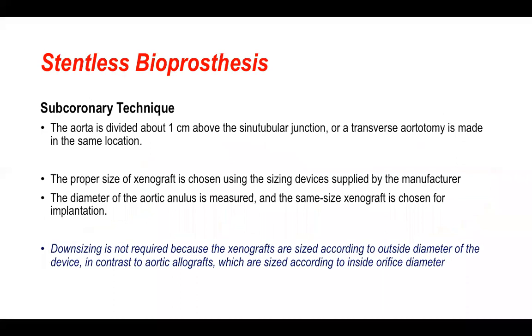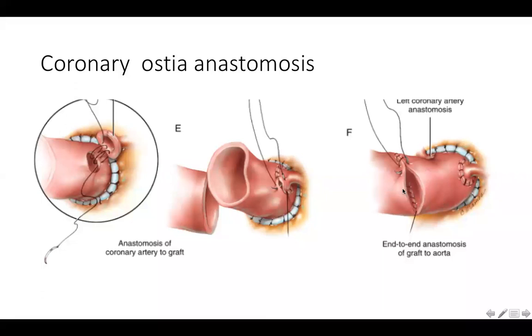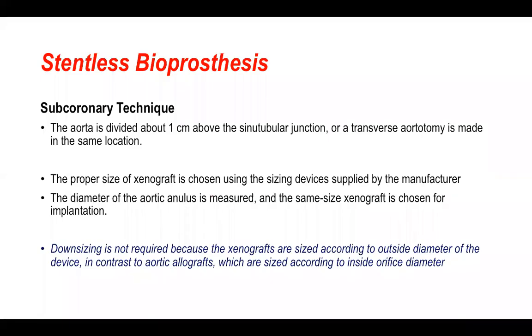After you fill the aorta, you find the correct location for the right coronary ostia.